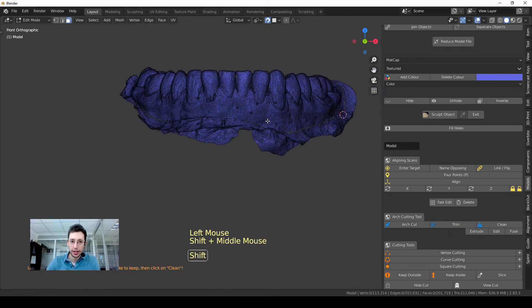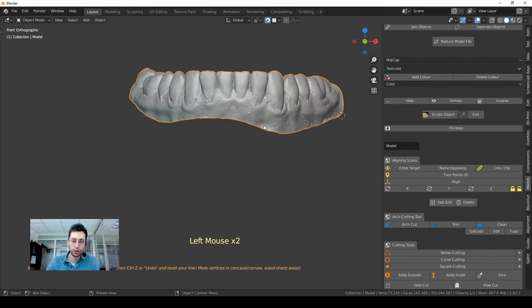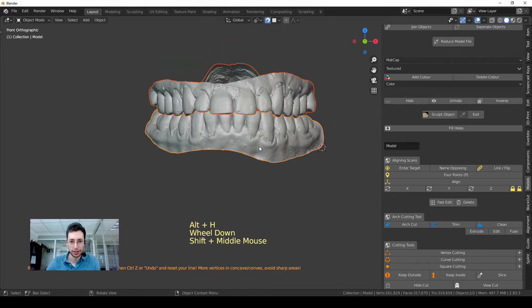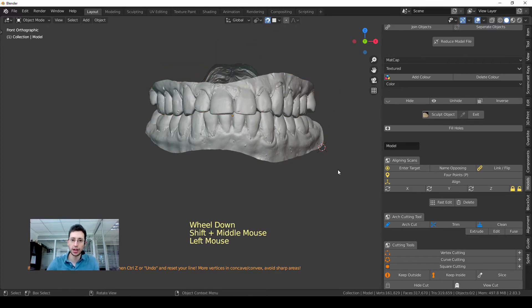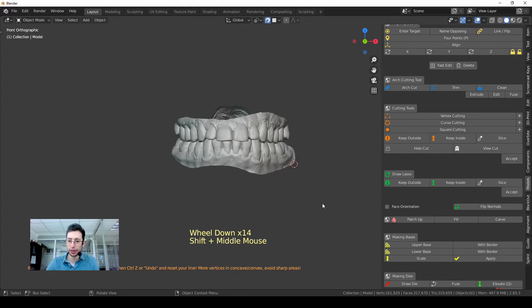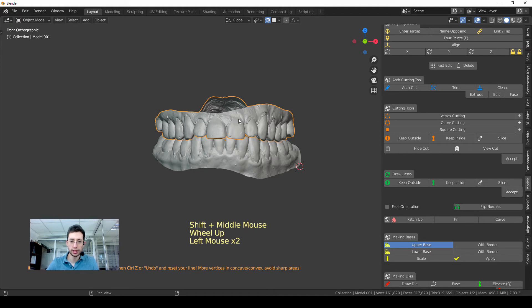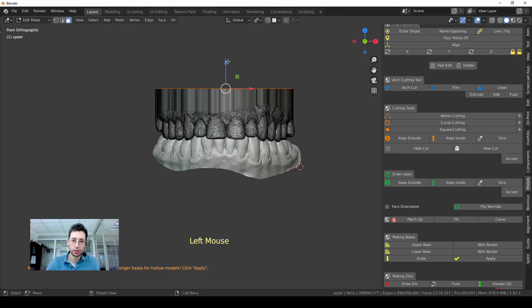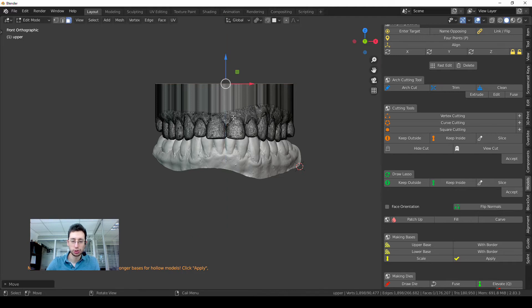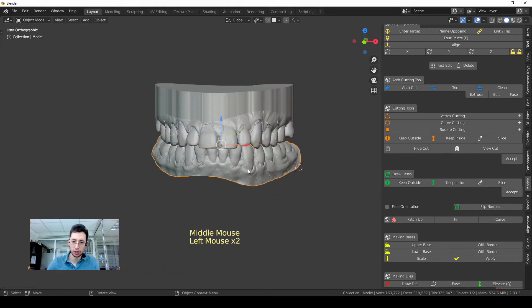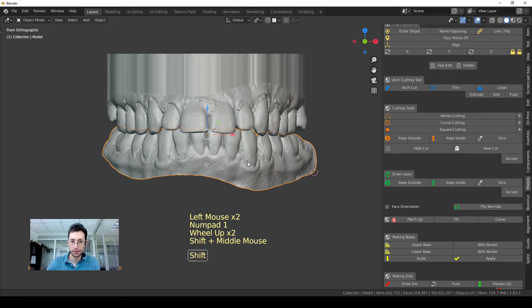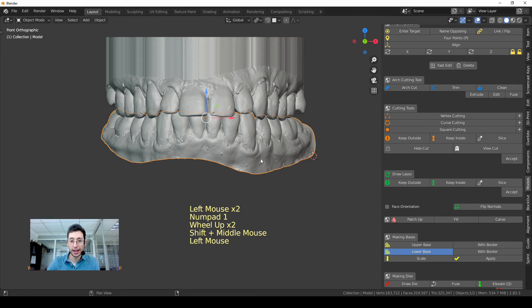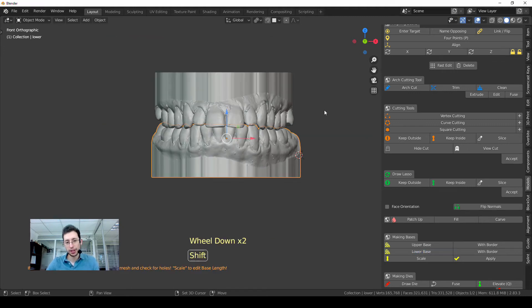So now I have to create bases. That's very easy. I have my Making Bases tool here. Upper Base will make an automatic base. In here I can change the size with this Scale option and then move this arrow up or down in order to make it a little bit thicker, but usually the default size is okay. Lower Base, the same thing.